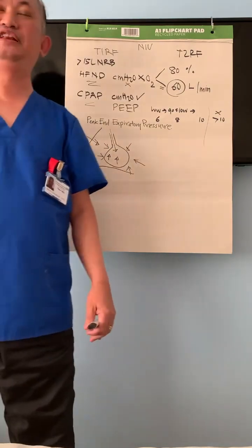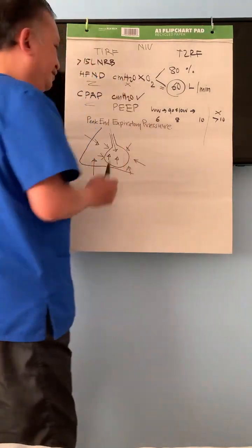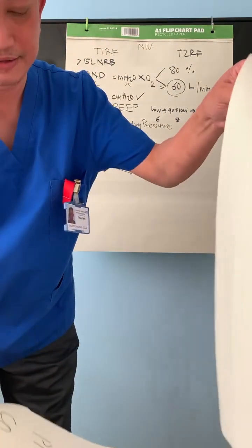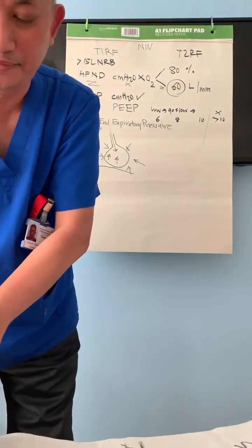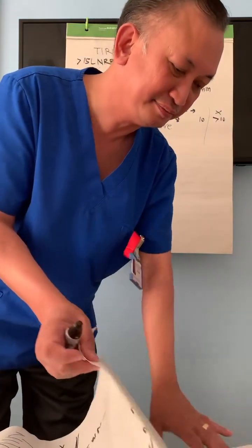So the patient feels suffocation. So usually, yes, we use CPAP in pneumonia, pulmonary edema, ARDS, as we discussed before. Yes, we start low, we go slow, and not more than 10, in most cases.